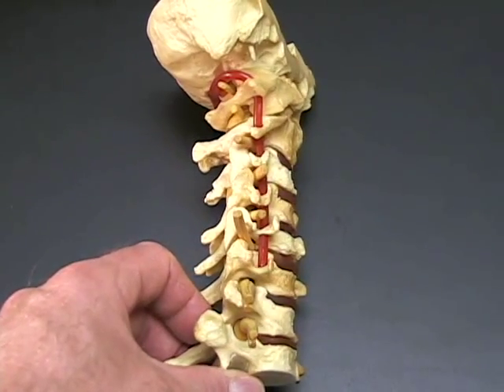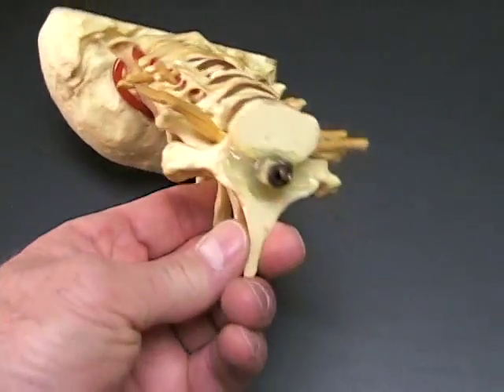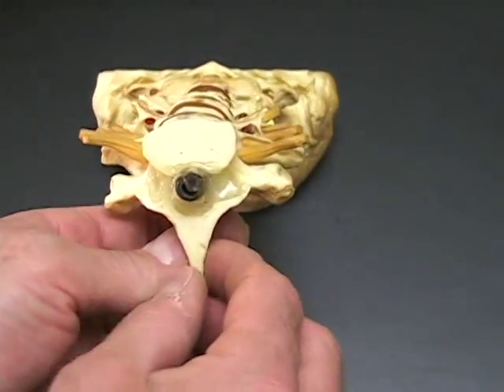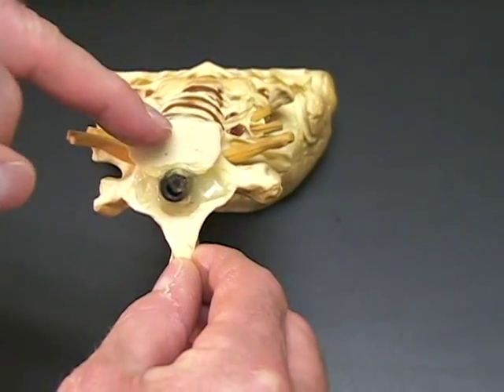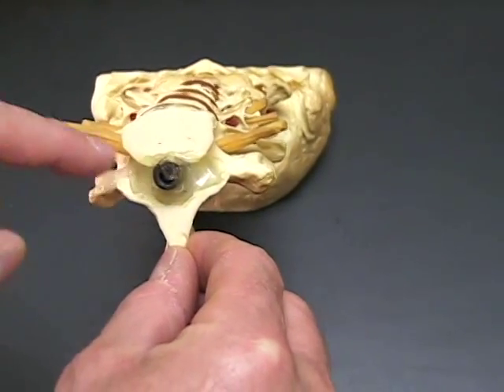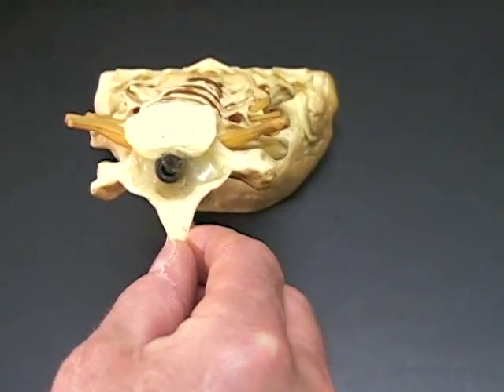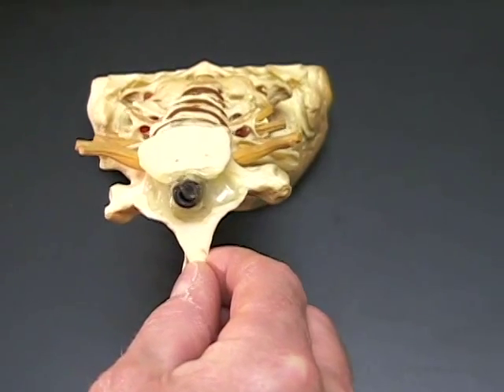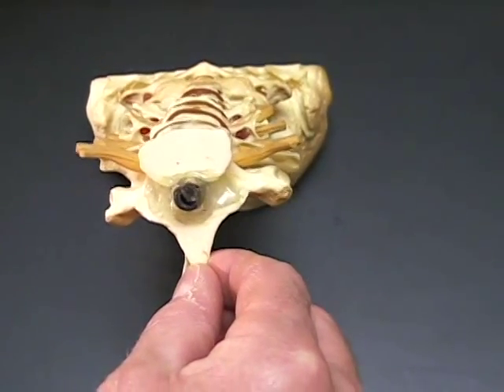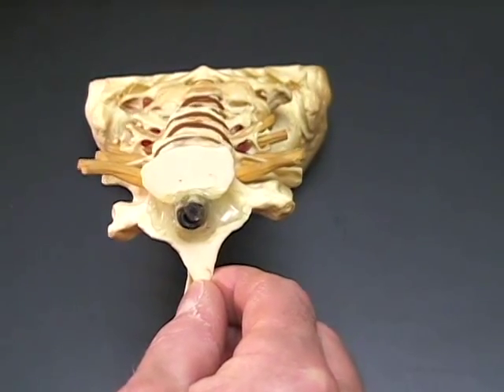There are other views on the MRI scan that are called axial views, which are views that are taken in this manner here, where we have the vertebral body or disc in front, the spinal cord in this position, and then the holes where the nerves exit and go in towards the arms through their holes, which are called the foramen. So these are the images that we'll see on the MRI scans.